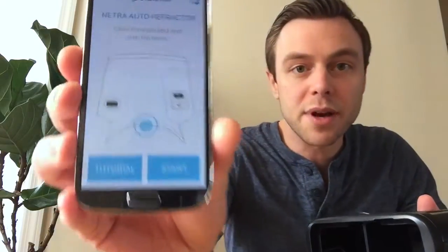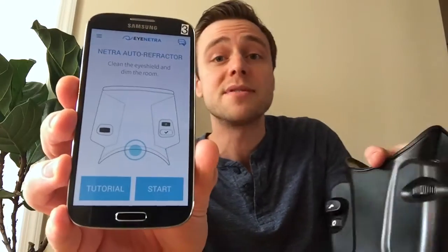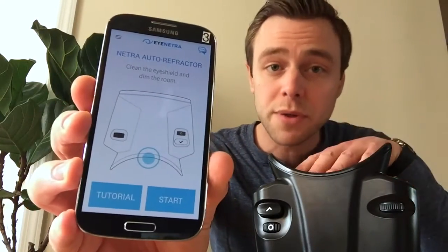I power it on and open up the Netra application, and you'll see there's an option for tutorial. We recommend that you run your patients through the tutorial each time, so they have a simulation of what they're looking for before they look inside the device.